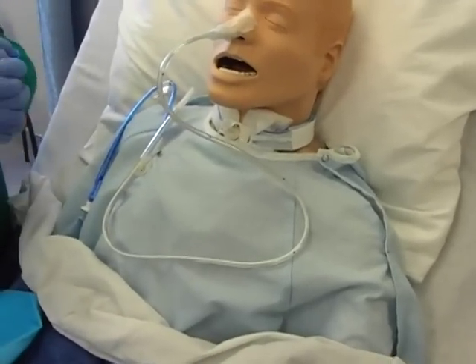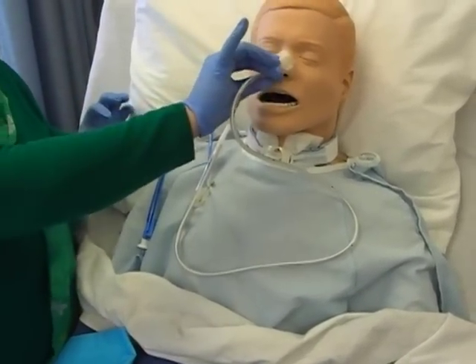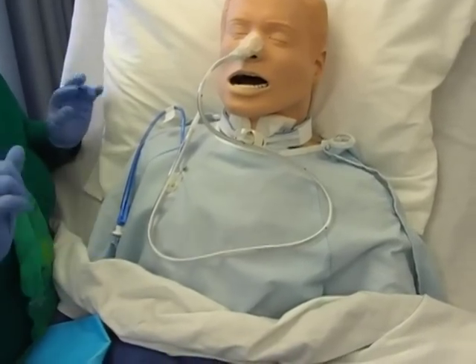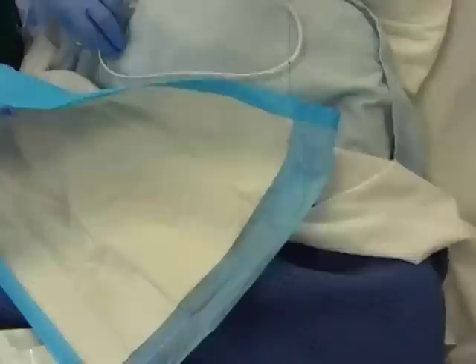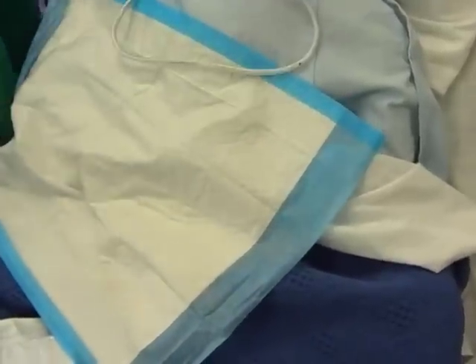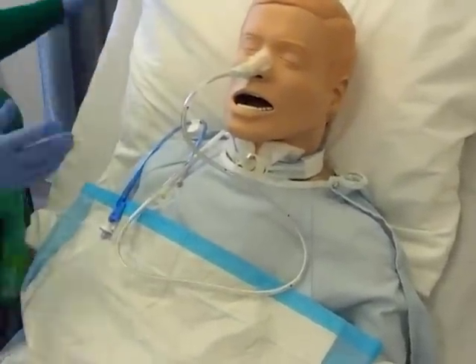Be sure you are wearing gloves throughout this procedure — we are dealing with the nose and anything else that may come out. We also used a chuck pad to keep the area clean. That covers NG tube insertion.